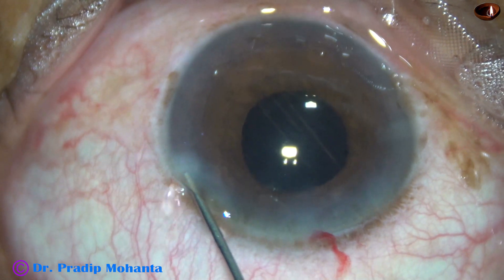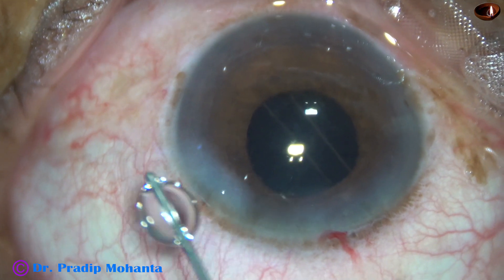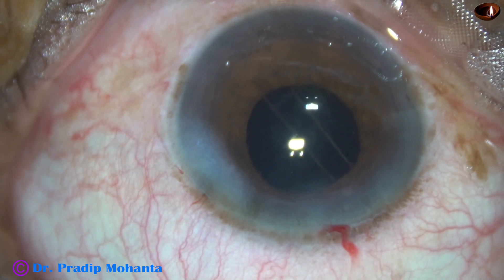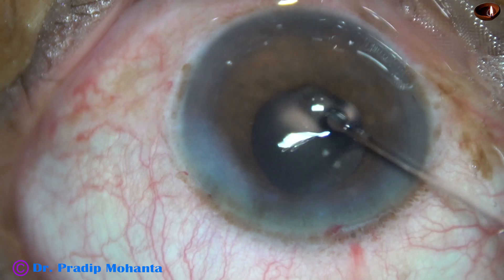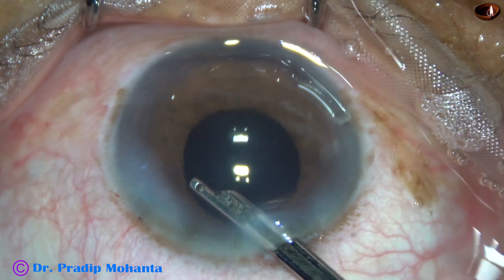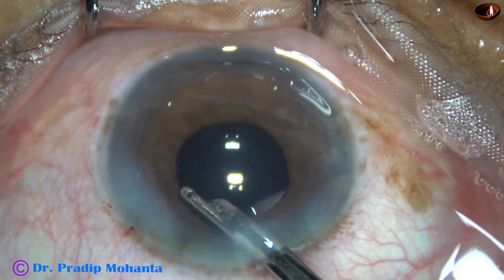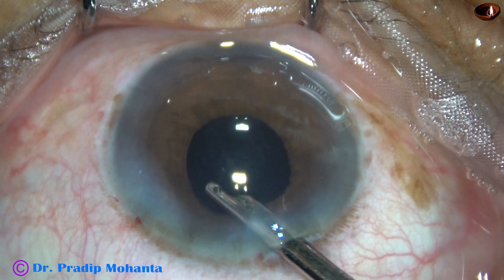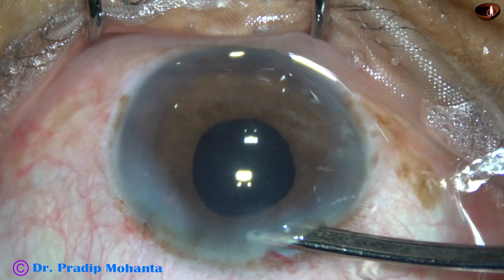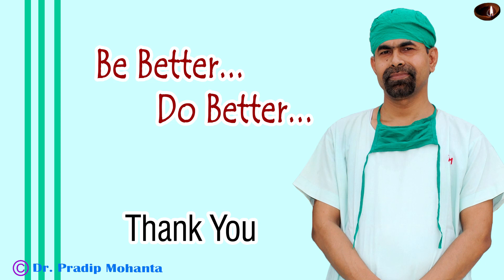And now the side port is closed by hydrating corneal stroma on either side of the stab wound. Now is the final lavage of the anterior chamber. The visco cleaning part has been edited a bit — the part which showed visco cleaning from the capsular bag has been edited out. The anterior chamber is nicely formed and the case is concluded. Thank you very much for your attention. I hope this video will help you in developing your surgical skills. Be a great surgeon and serve your patients with love, respect, compassion, and great surgical skills.